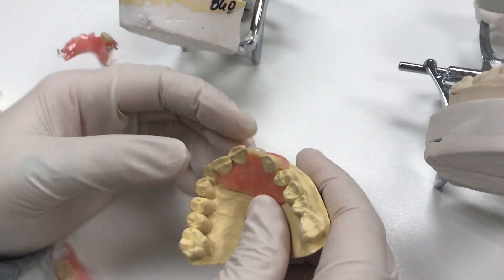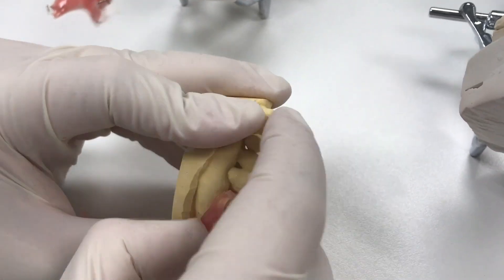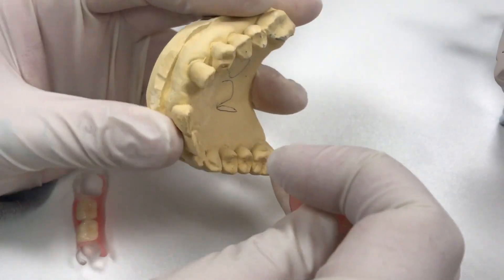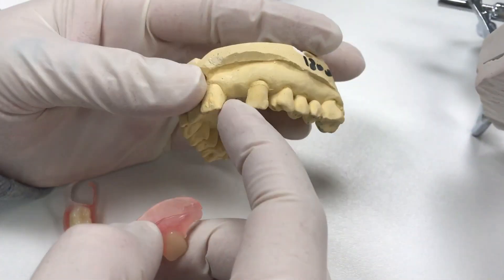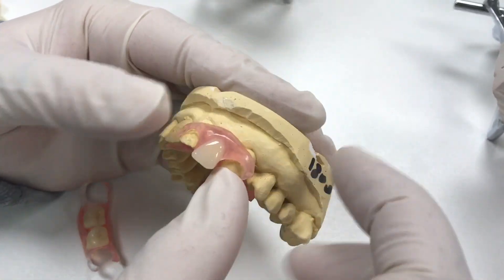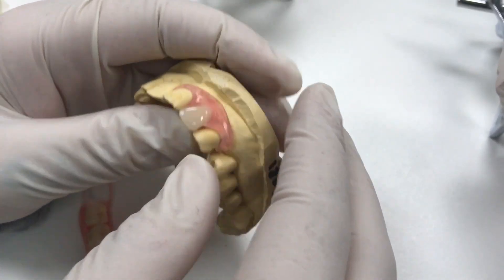We have another one-tooth Nesbit — another temporary option. Patients do these a lot over implants. They get an implant and the doctor can adjust for the healing cap. We have these for temporary use and also a lot of these for permanent restorations as well.